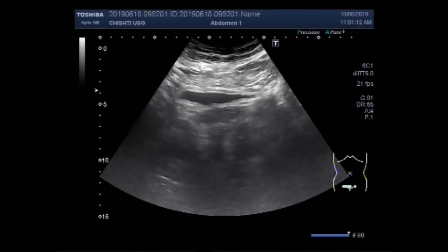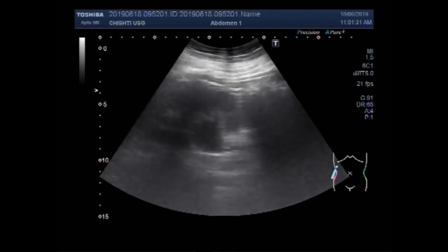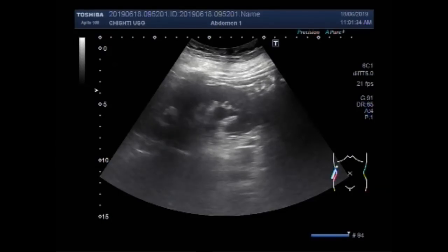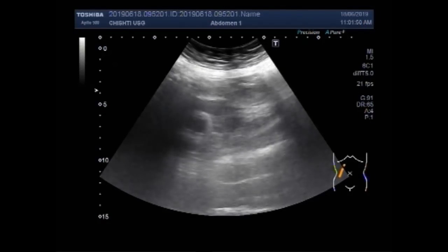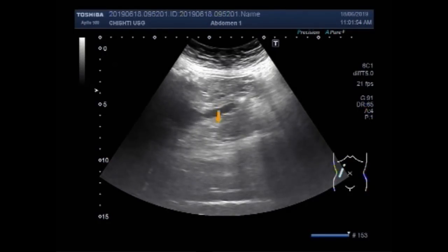Now you can see there is a little amount of urine seen in the urinary bladder. Now again you can see the right kidney, and you will see the scanning of the right ureter. Please see the probe position. Now you can see this is the right ureter.